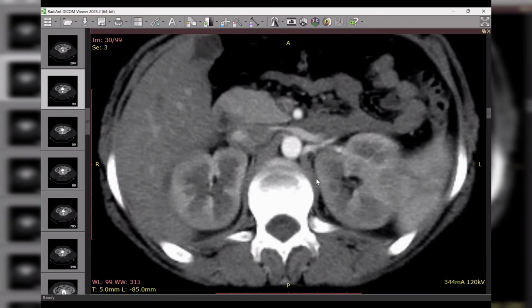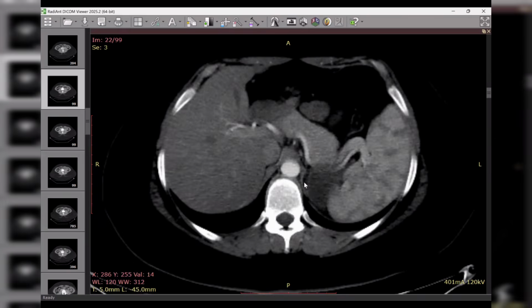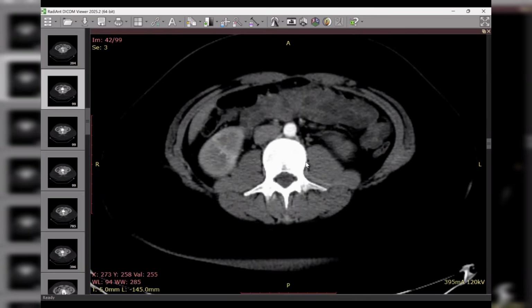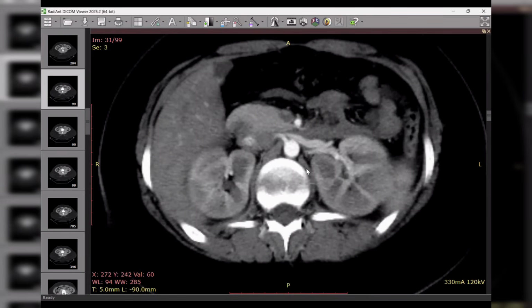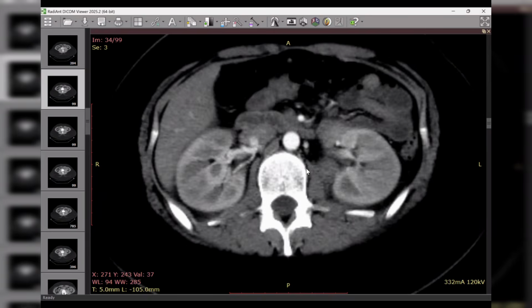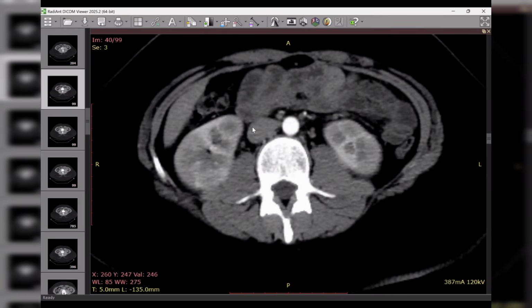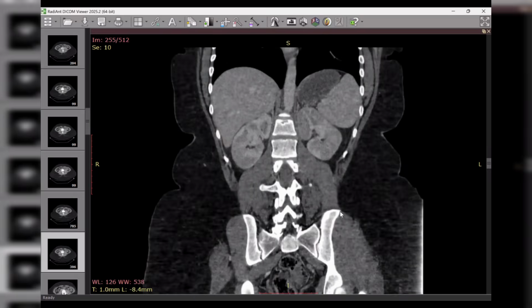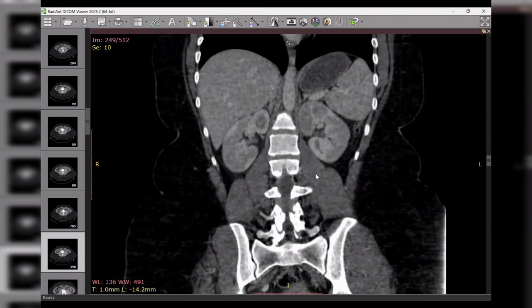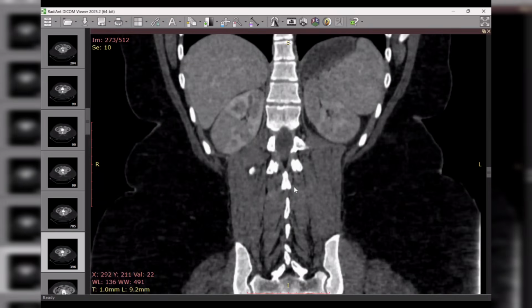You want to ask what medical illness she is taking? Yes, the renal vein. I will also look for the renal vein. Nice, it is patent. The renal vein is patent, and the other vein is also patent. So can this be an appearance of multiple infarctions, ischemia, or chronic ischemia? Yes, it could be chronic ischemia, even with patent vessels.